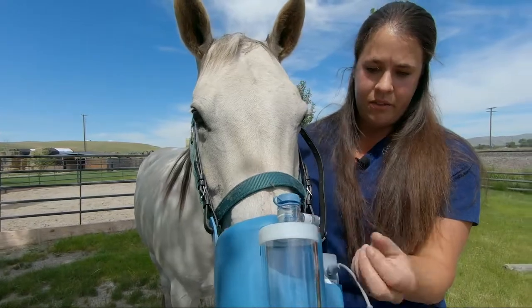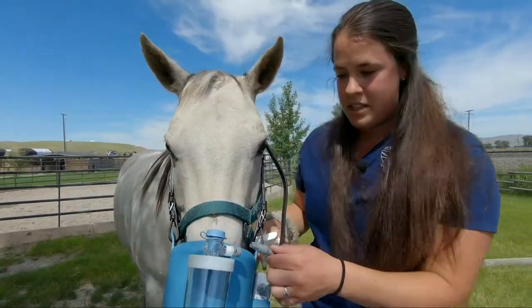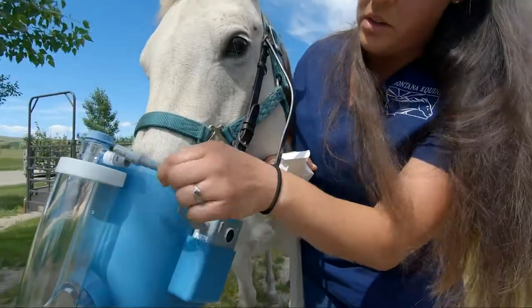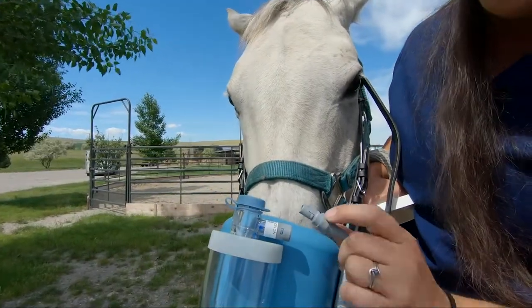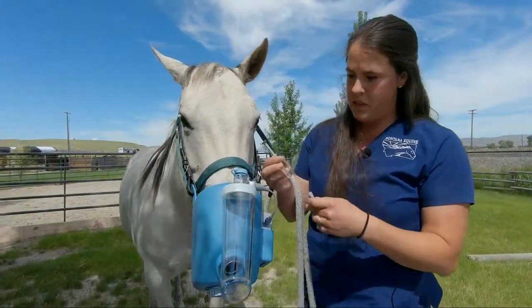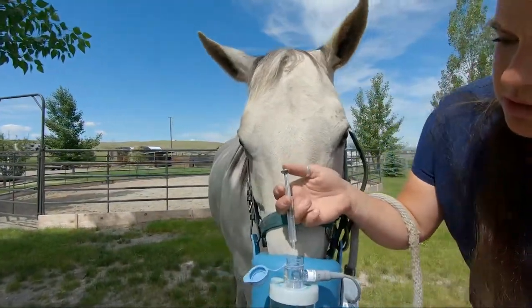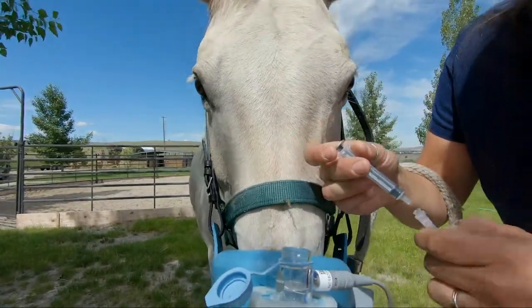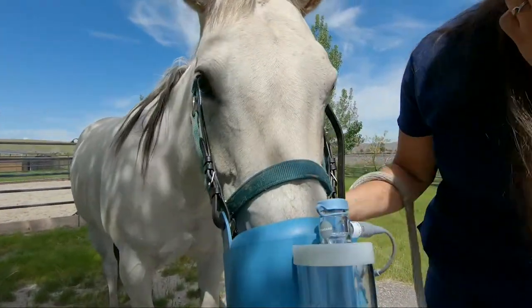You'll take off this plastic piece — keep hold of this because it's important to have. The next thing you'll do is insert the battery pack here and plug it into the cup itself, so this arrow to that arrow. Then you'll place your medication — this is just sterile saline — directly into the cup itself. The most important part is to make sure this cap gets closed so that it's airtight.